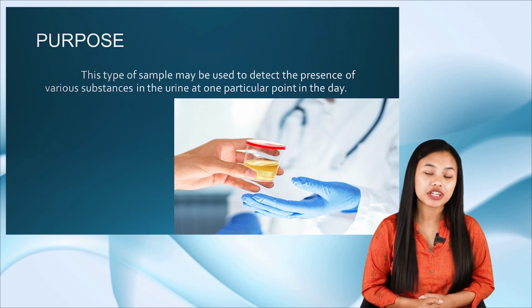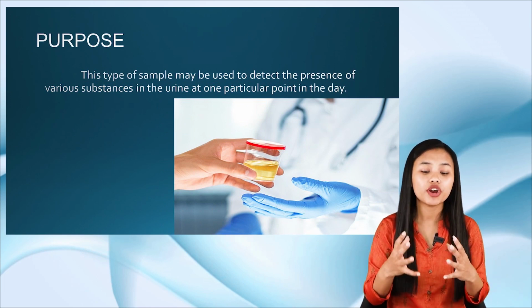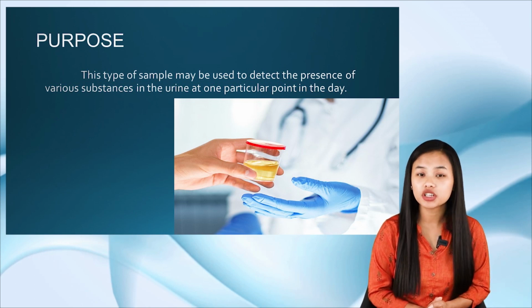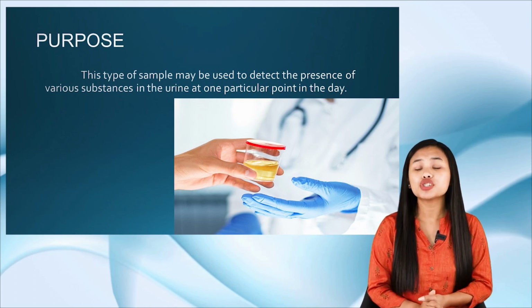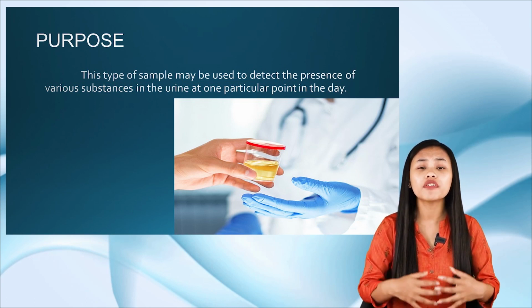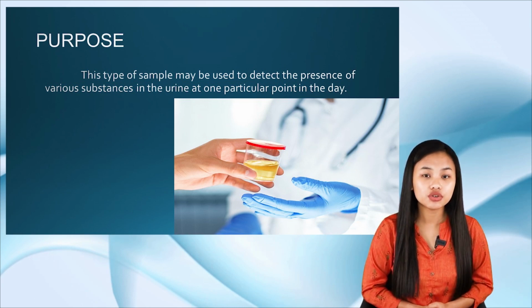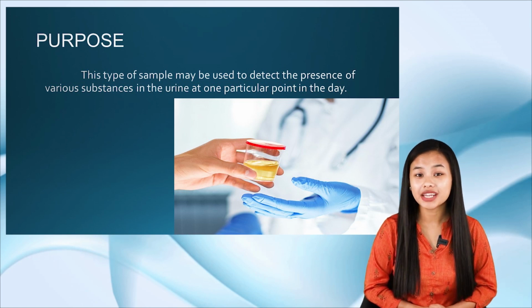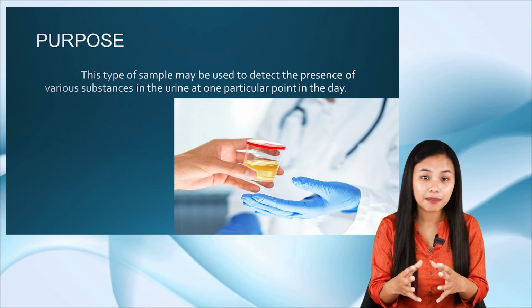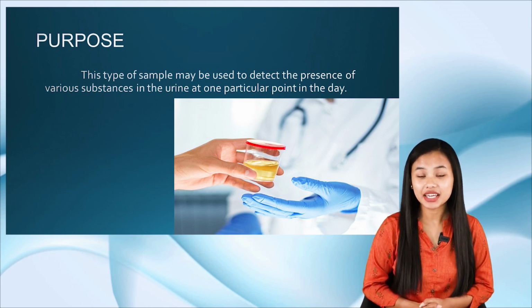And also this type of sample may be used to detect the presence of various substances in the urine at one particular point of the day. And also, while collecting this sample, no special handling is required.